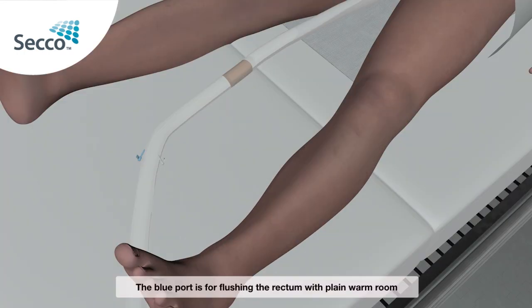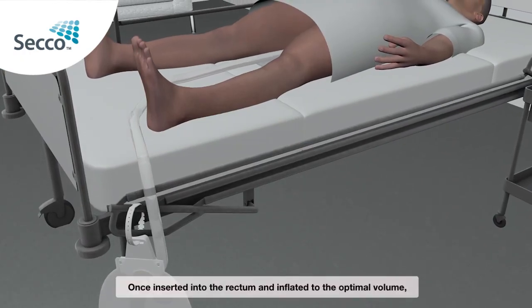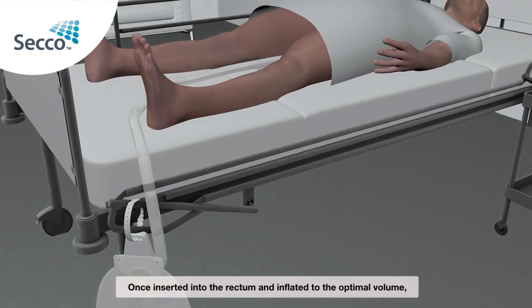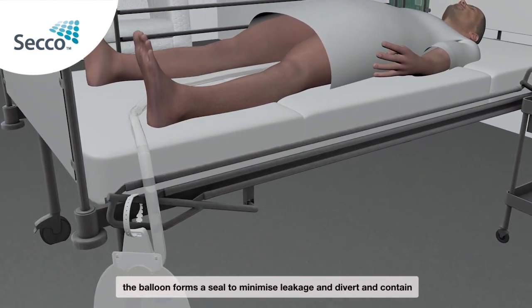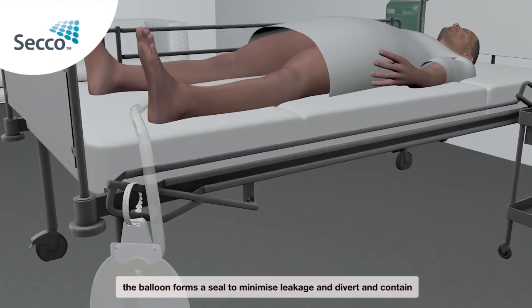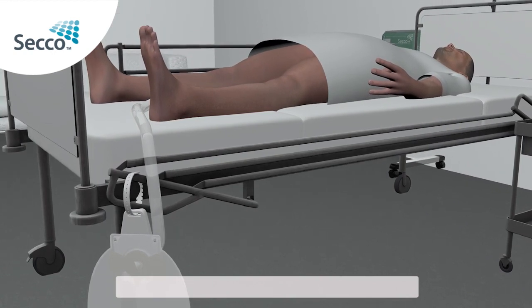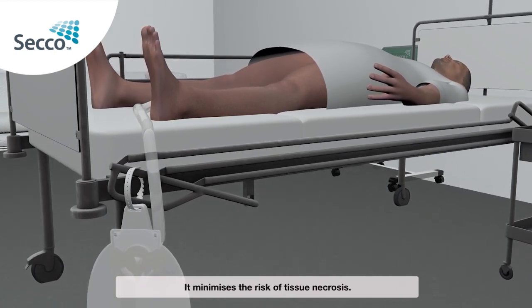The blue port is for flushing the rectum with plain warm room temperature water if it becomes blocked with solids. Once inserted into the rectum and inflated to the optimal volume, the balloon forms a seal to minimise leakage and divert and contain liquid feces. It minimises the risk of tissue necrosis.